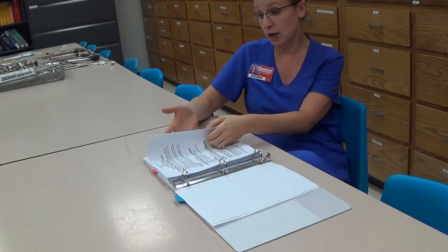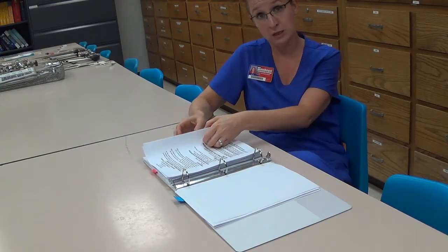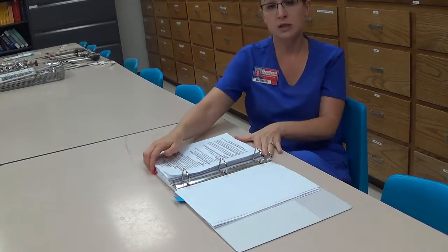Now for the draping checkoff, which will be one of those checkoffs back here in the same section as the Bookwalter checkoff, the students will just need to drape a laparotomy draping with 4 square off towels and a laparotomy sheet with you, which is just the basic draping that we will be utilizing for the laparotomy competency assessment. So you just need to watch them apply that, make sure they put it on in the correct order and they're utilizing the correct aseptic principles, and then you'll check them off on that one.